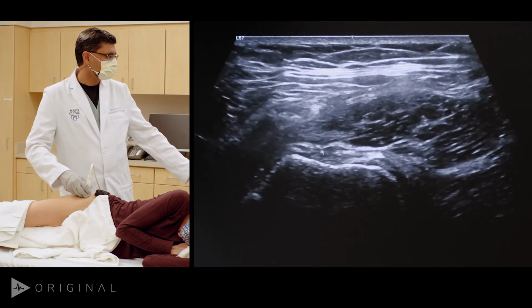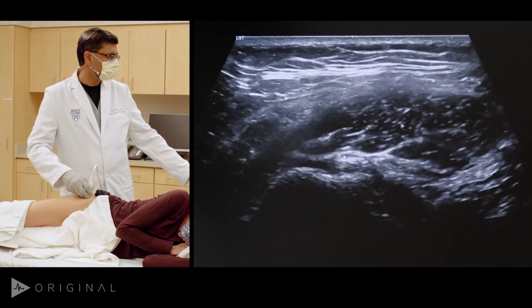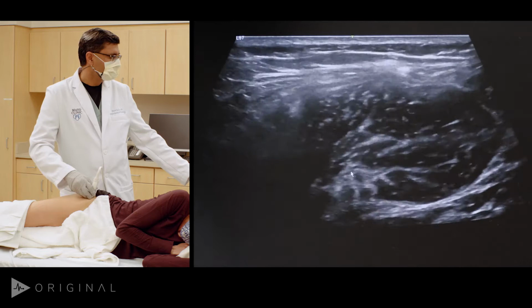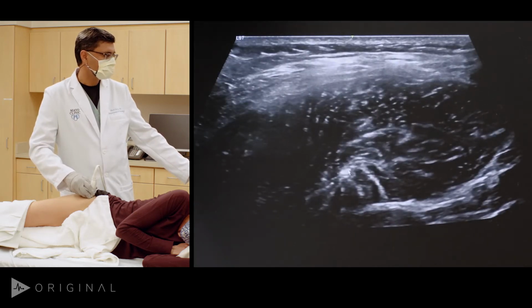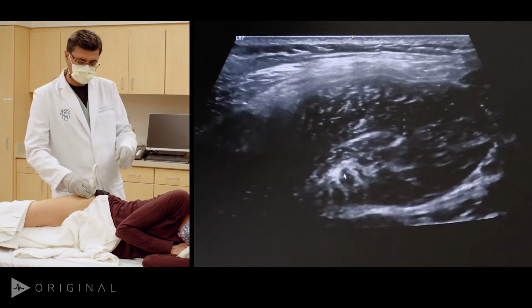Now, this is a fairly broad gluteus minimus tendon here. Now, as I proceed proximally, see how the tendon becomes a little bit more prominent anteriorly, and as I go further out, the tendon starts spreading out and disappears. Why? Because it forms the anterior aponeurosis of the gluteus minimus tendon. Now this is really useful though.